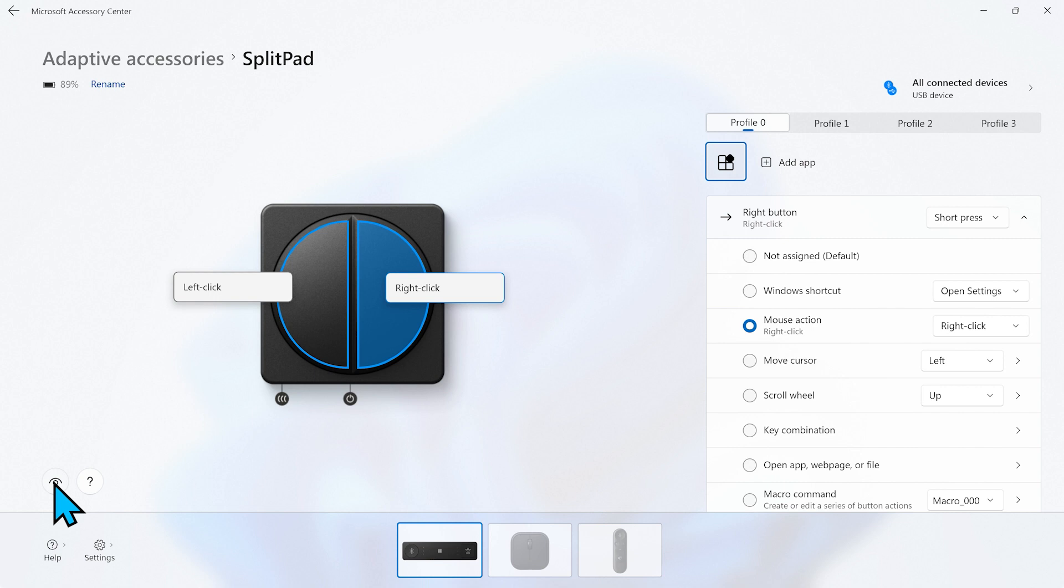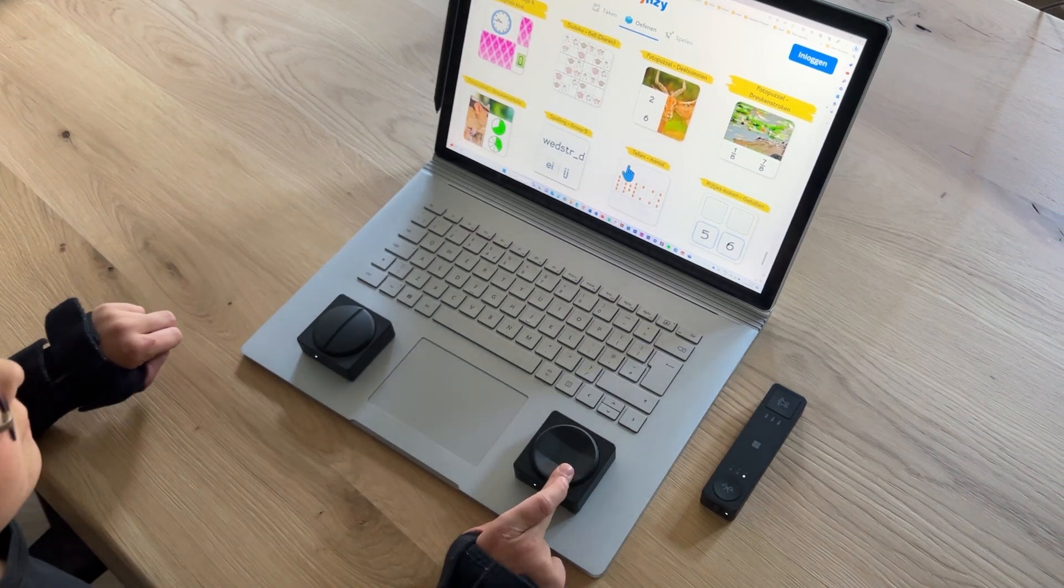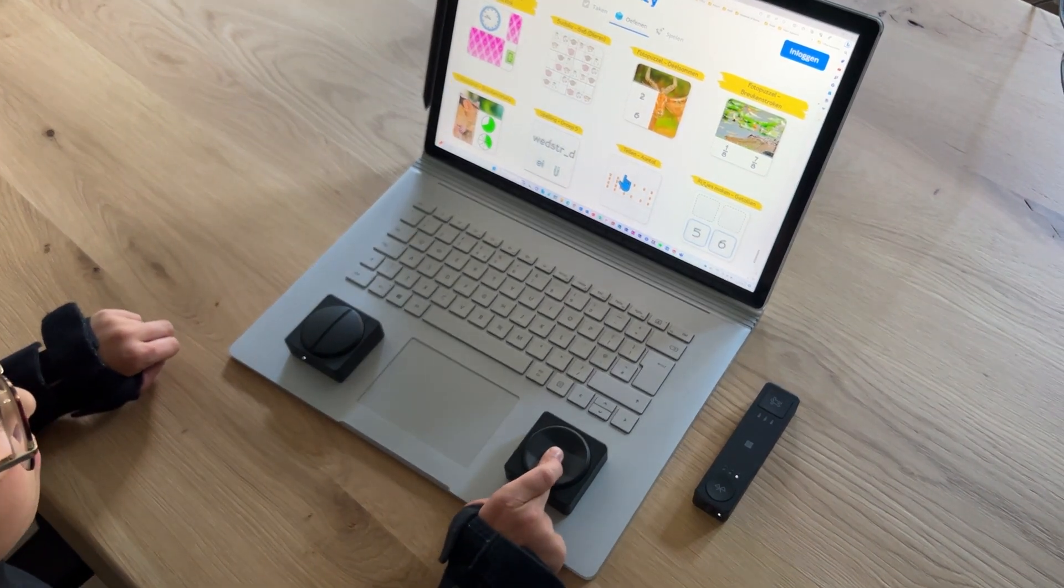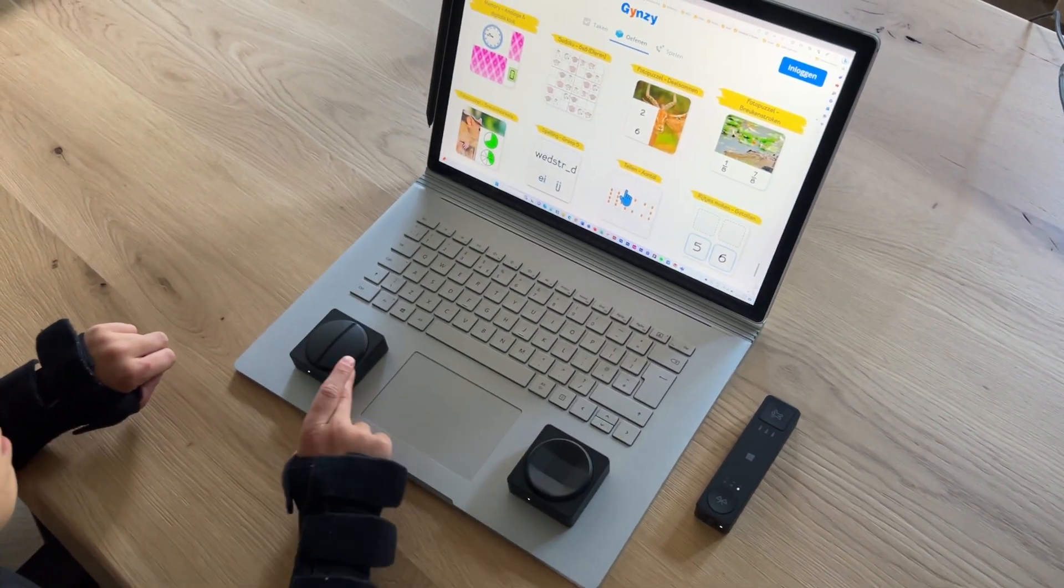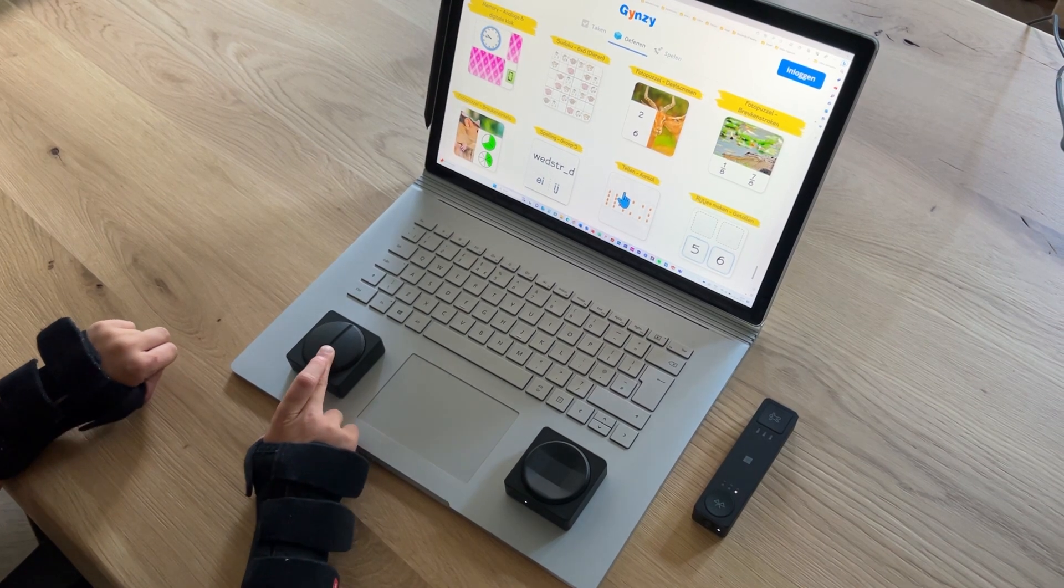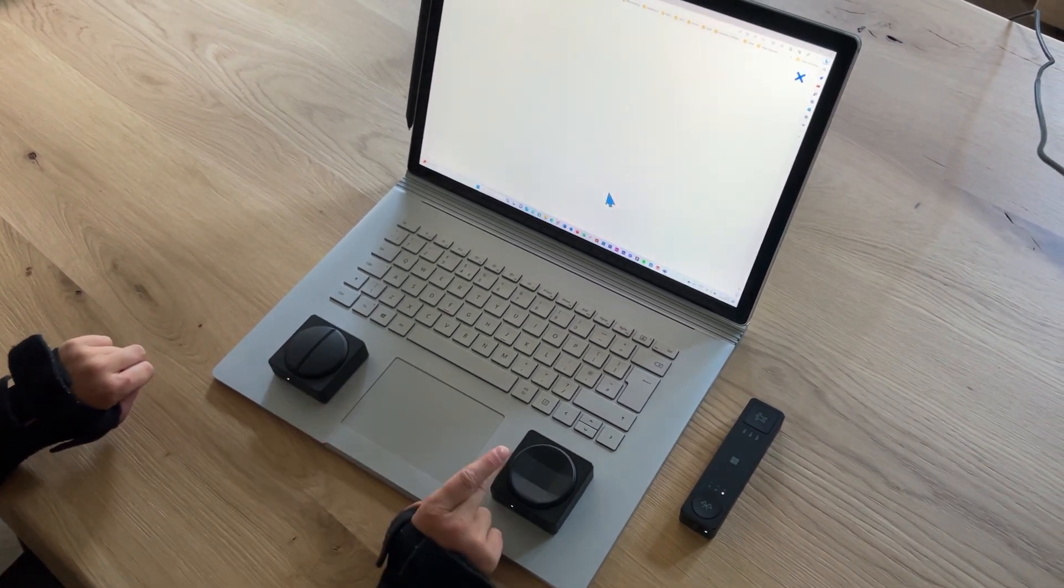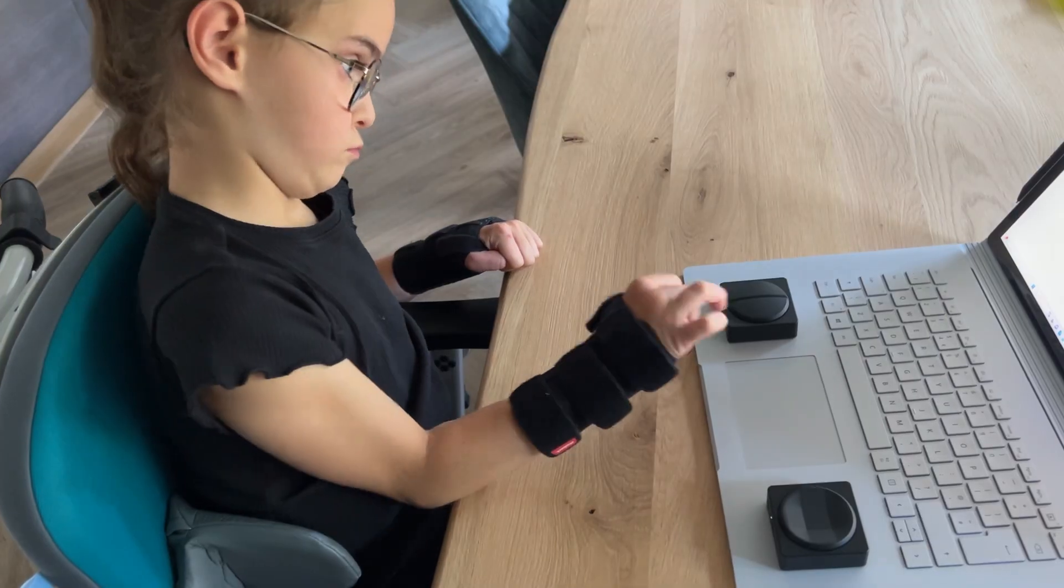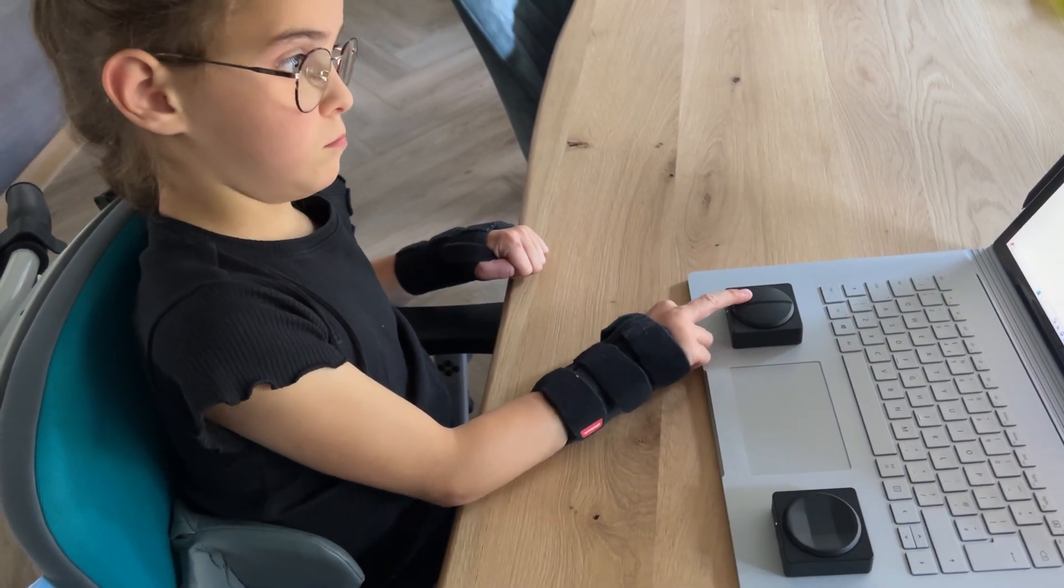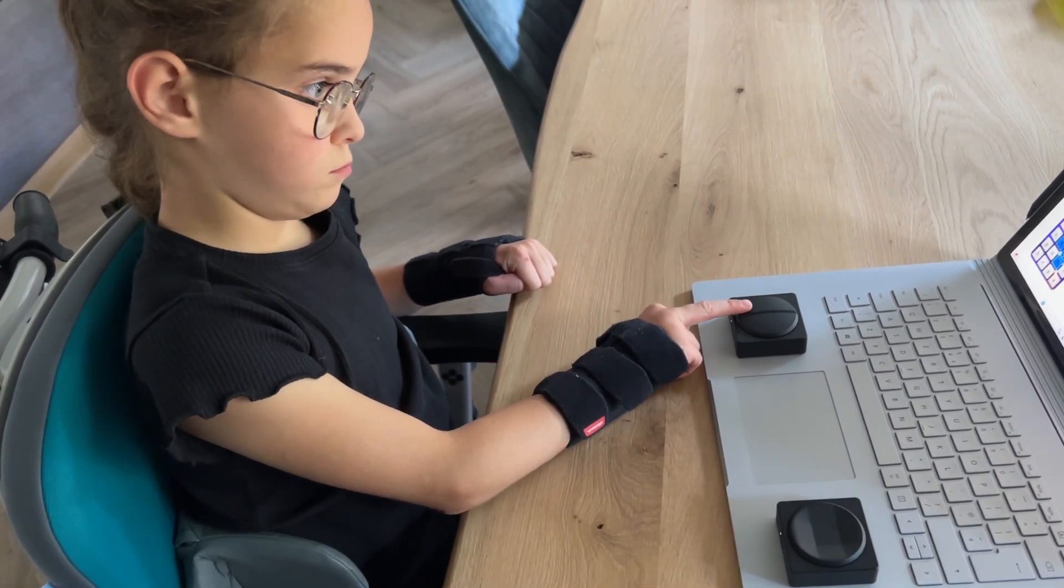Now we're done with the setup. Let's see them in action. As you can see Yara can easily control her PC using only these two buttons. Now think about adding another button for copy, paste, open applications, browse websites. Basically do anything else you want to do with your system.